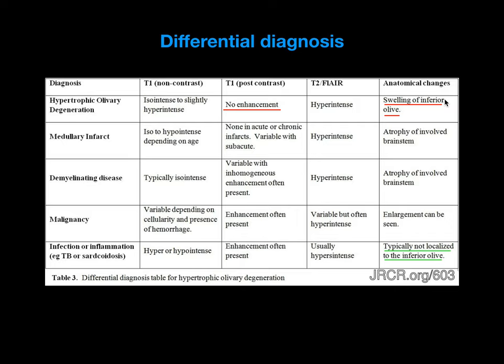Coming to differential diagnosis, always remember medullary infarct, demyelinating diseases, malignancy, and infection or inflammation such as tuberculosis or sarcoidosis. Look for the characteristic features. The important thing to remember is that in hypertrophic olivary degeneration there is no post-contrast enhancement, and the olivary nucleus is swollen and enlarged, which has a classic appearance.